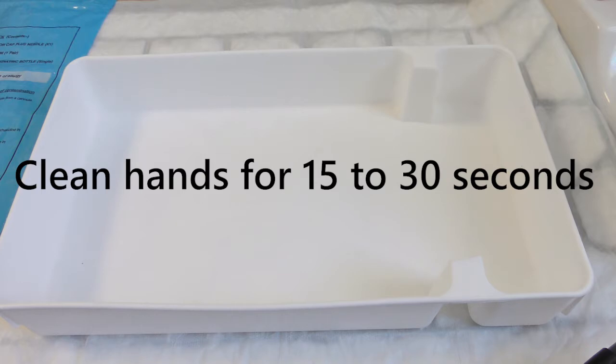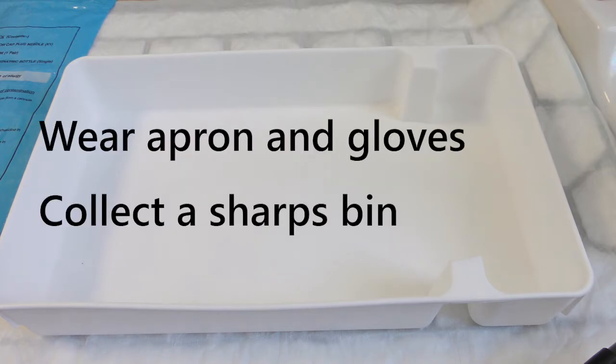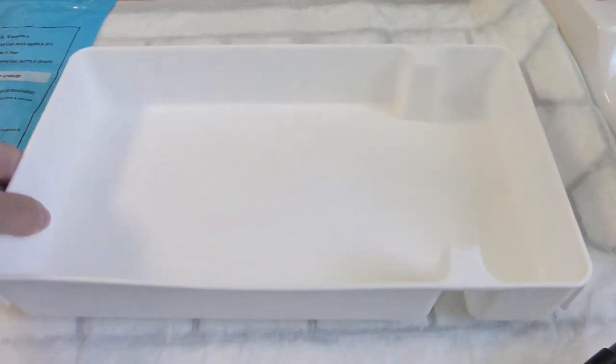Wash your hands and put on an apron. Collect a sharps bin. Gather and prepare all the equipment into a clean plastic tray.